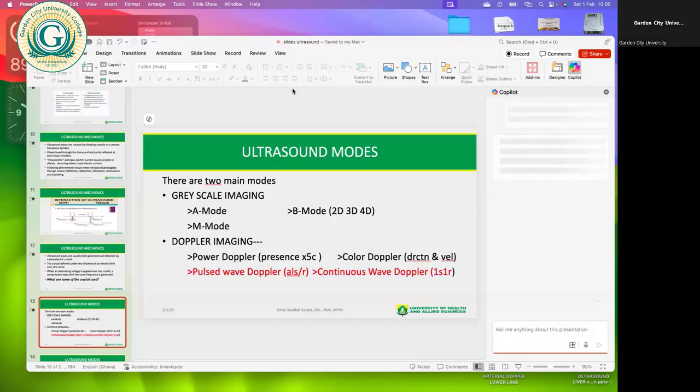So for instance, when I take your urinary bladder filled with urine, it will not be as dense. It is comparable to a balloon filled with water. It will not be as dense or as compact as when I take your liver, which could be compared to, say, yam. Are we following?